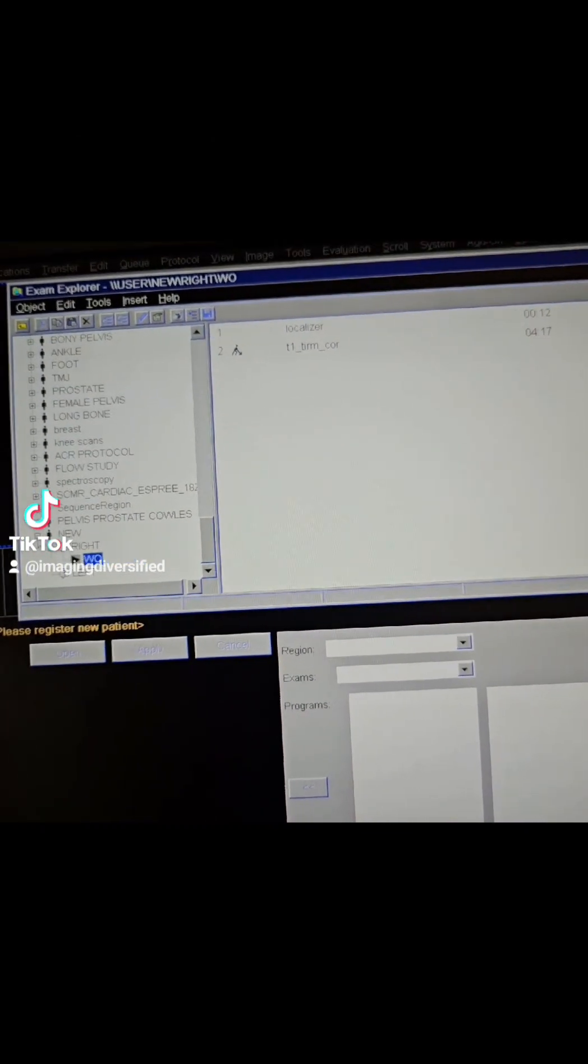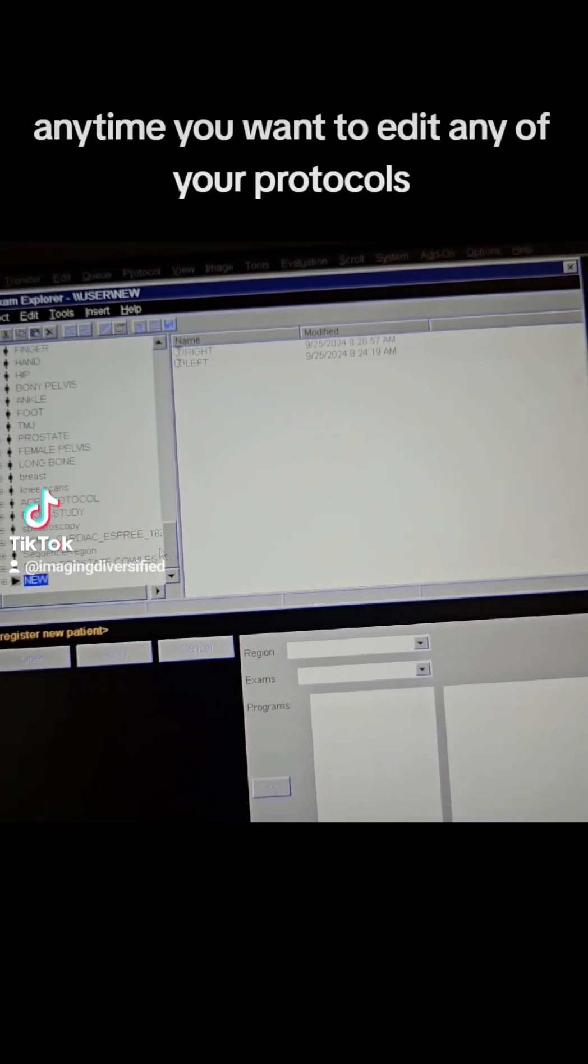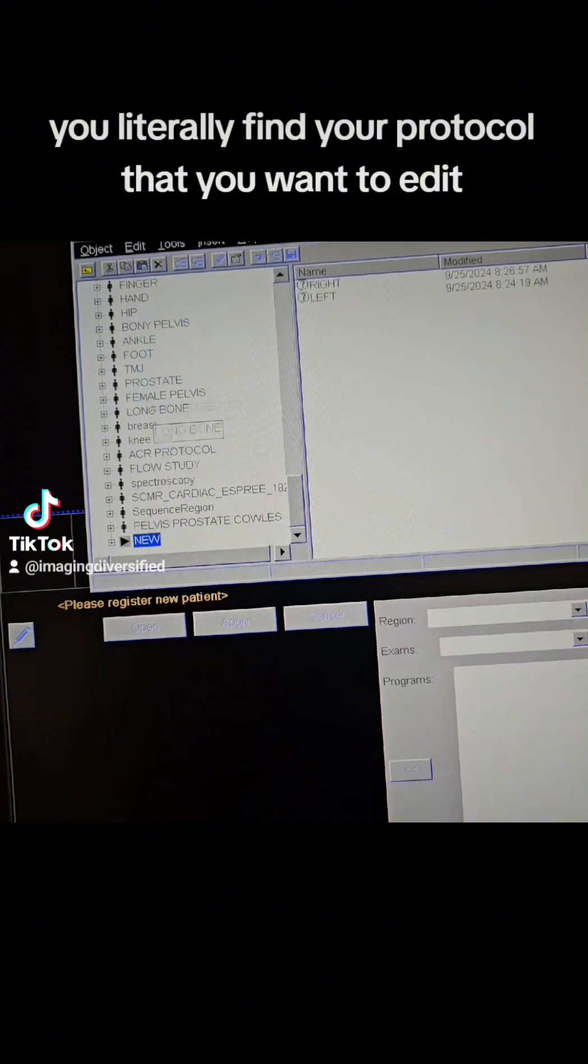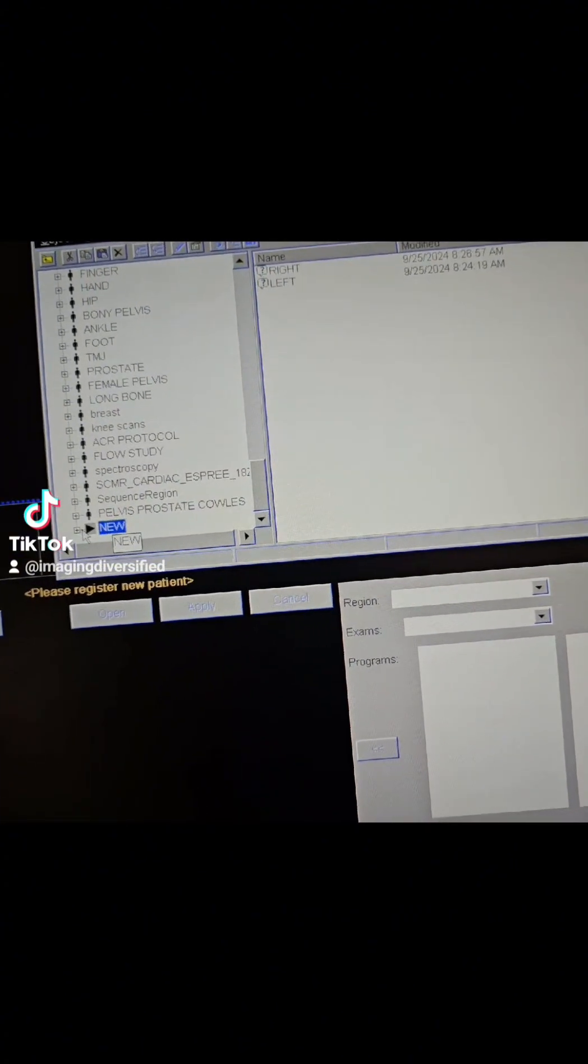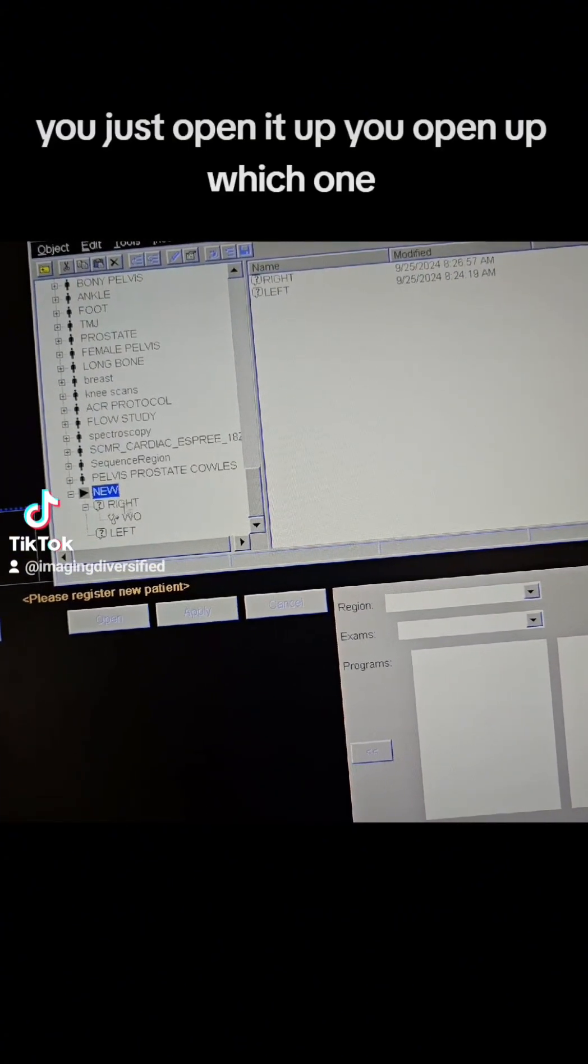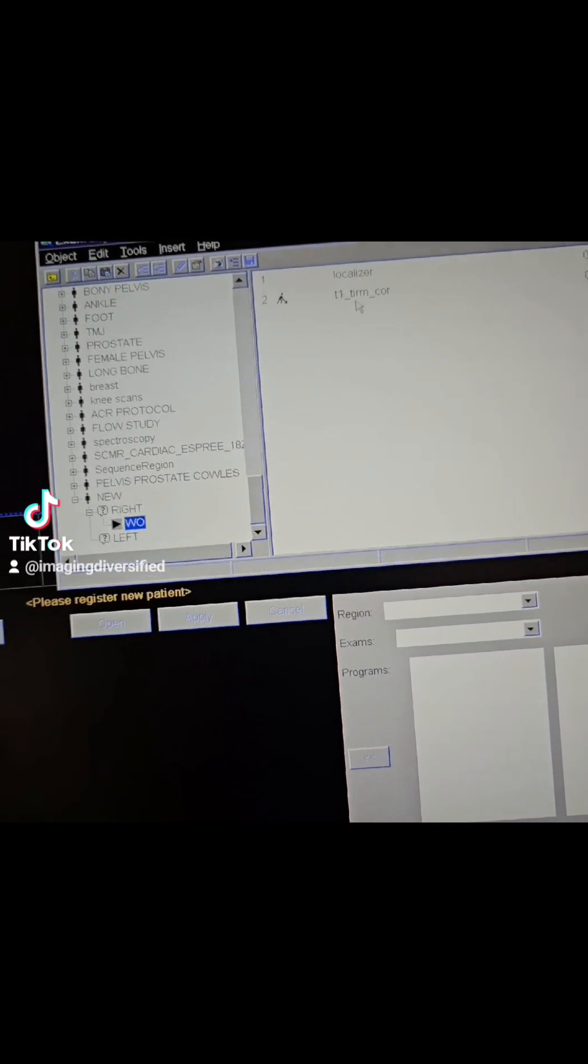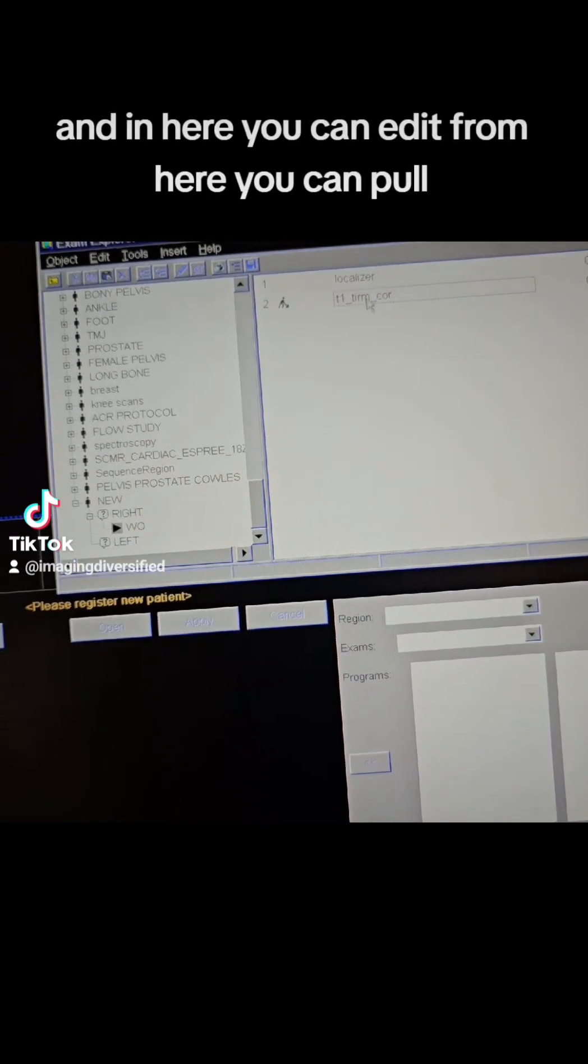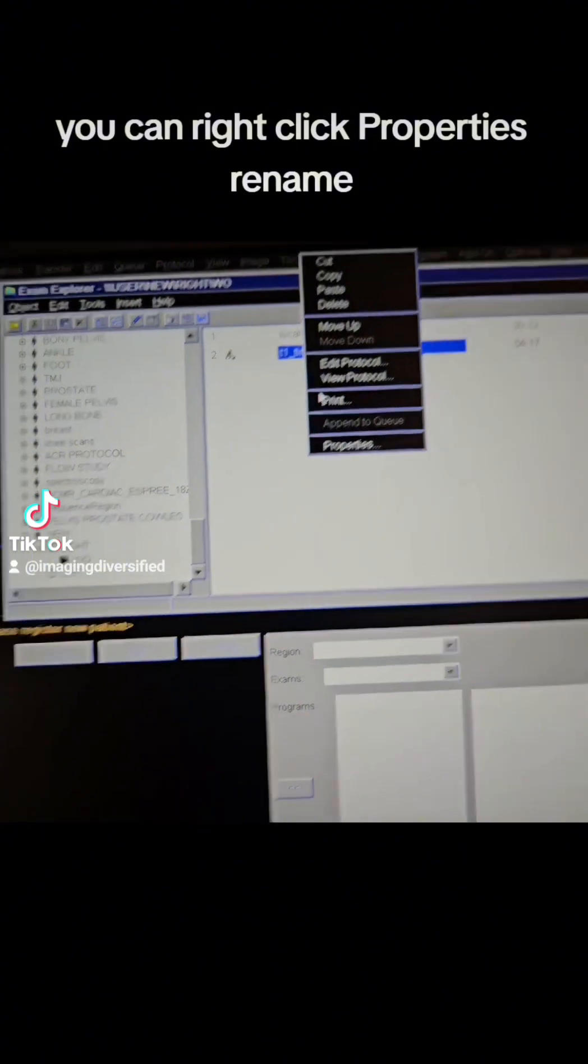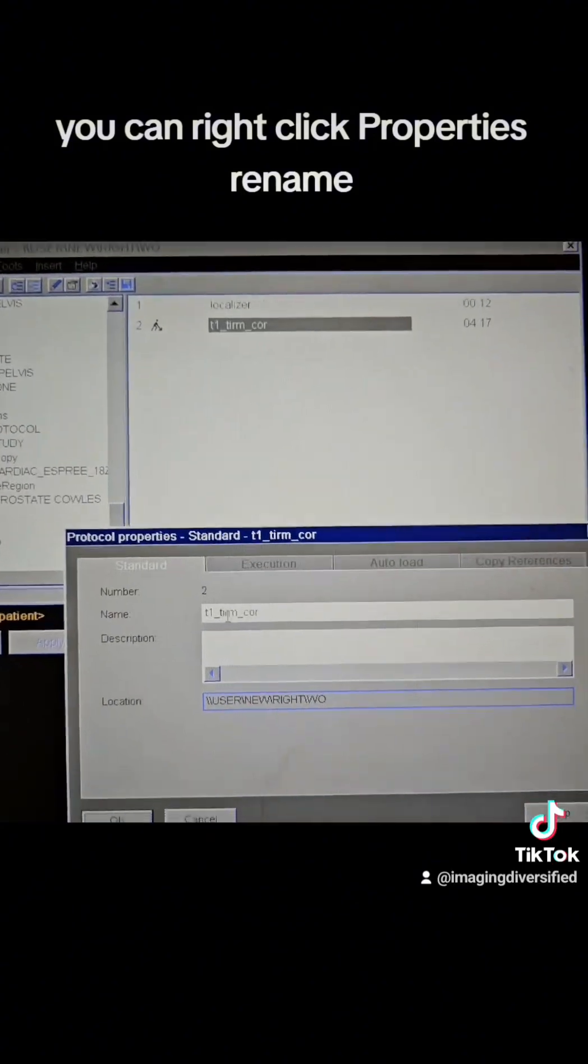Now, anytime you want to edit any of your protocols, you literally find your protocol that you want to edit. You just open it up, you open up which one, you see what's in it. And in here, you can edit from here, you can pull, you can right-click, properties, rename.